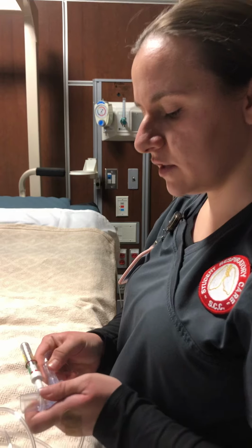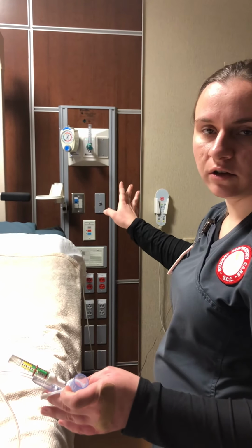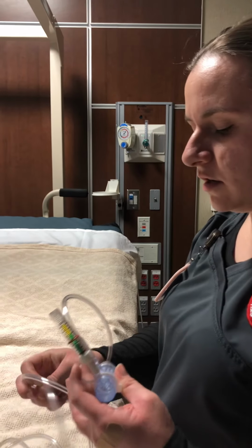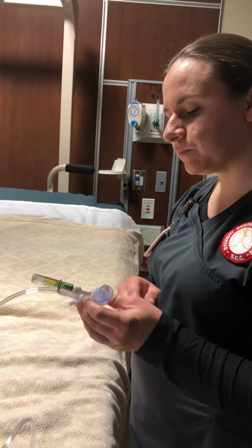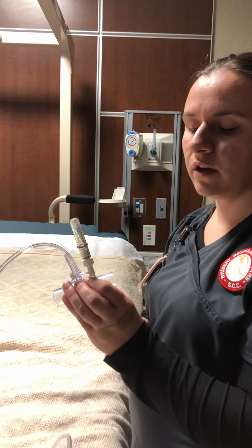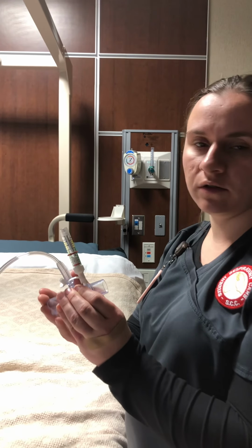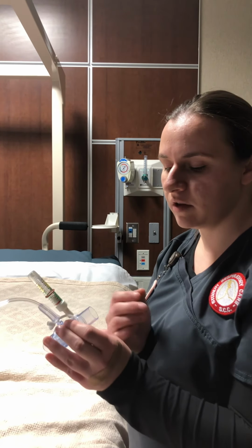So you connect it to the oxygen source, and then you connect it to the Thorpe tube over there, and you would start it at 5 liters per minute. You don't want to exceed too high, that way you don't exceed the volume of the patient. So when you're ready, you're going to instruct the patient to hold it upright, not upside down because it won't read properly. And then to hold it off to the side, not to occlude the back side, because then you won't get that positive pressure through there like you need to get the appropriate treatment.